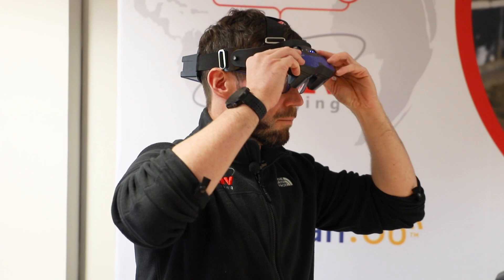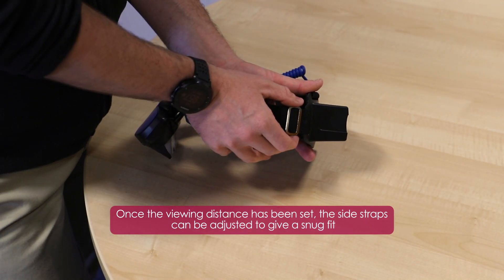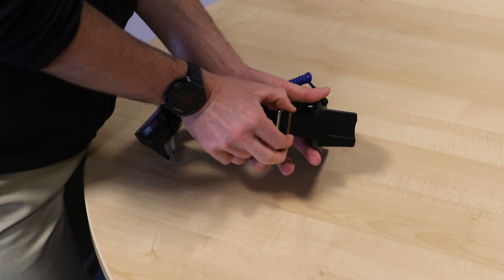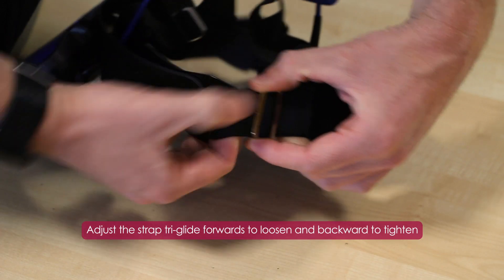Once the ultrasound image is looking good and the viewing distance has been set, the side straps can be adjusted to give a snug fit. Adjust the strap length by sliding the triglide forwards to loosen the fit and backwards to tighten.